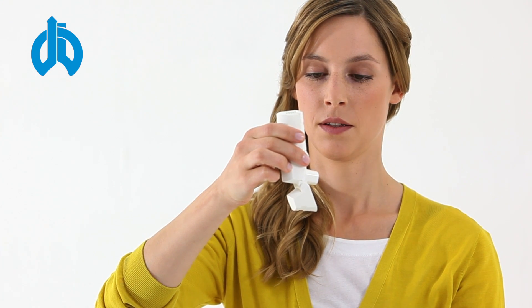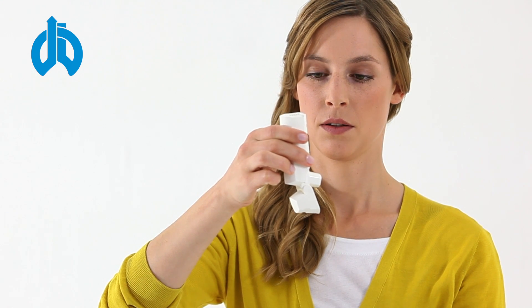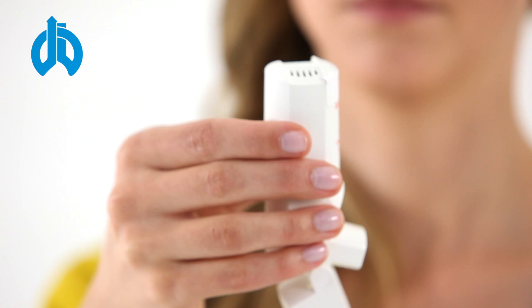Now take the Easy Breathe upright into your hand, ensuring that the mouthpiece is facing downwards and that the air vents at the top are not covered.